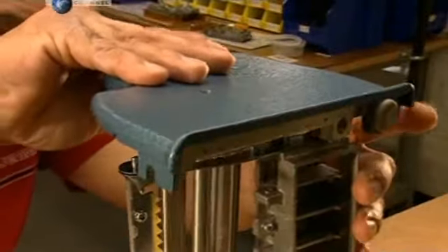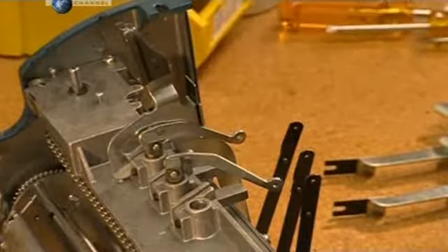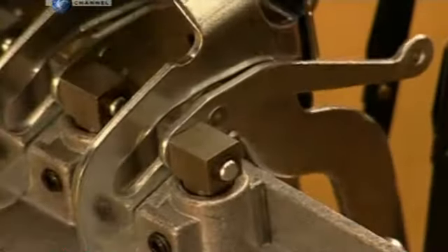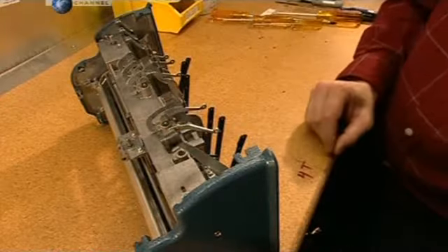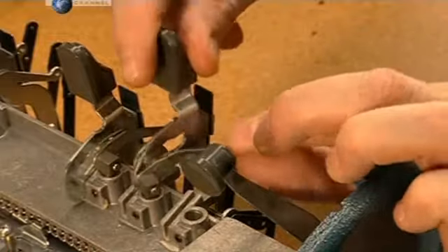The other side of the machine is closed off with the right end plate. Now the process of connecting the parts that move the styli can be completed. So far, each cam rod connects to a link. Now each link is connected to a cam lever, then each lever is fixed to a key.